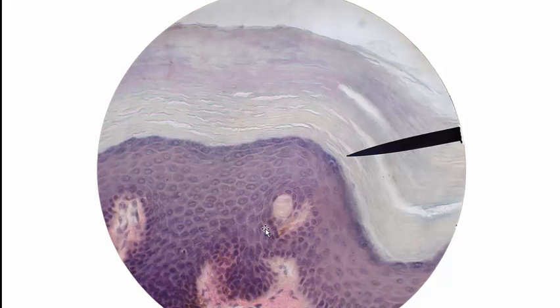Also in this image we have a receptor. This is a Meissner's corpuscle or tactile corpuscle. It's a sensor for touch. And I don't want you to think that this tactile corpuscle is inside of the epidermis. Only the tip of it is seen in the epidermis here.